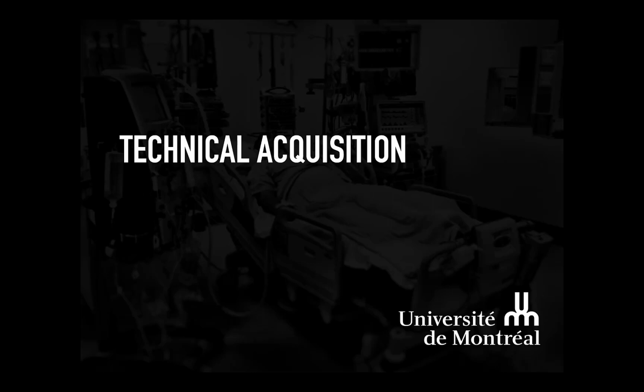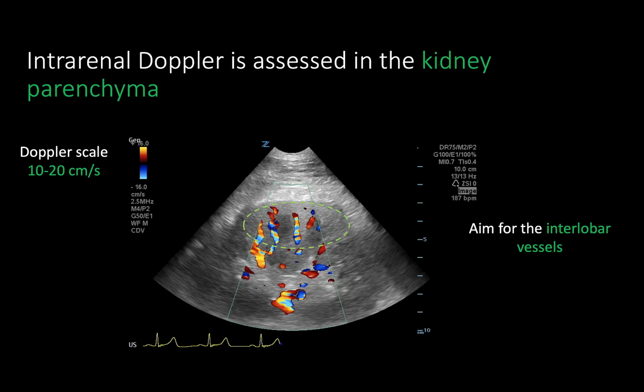We will now do a review of the technical acquisition principles for proper intrarenal Doppler assessment. Intrarenal Doppler assessment is performed within the kidney parenchyma at the level of the interlobar vessels. The artery and the vein travel in close proximity in this region. To adequately visualize interlobar vessels, it is important to adjust the color Doppler scale to detect low velocity signals in the range of 10 to 20 cm per second.